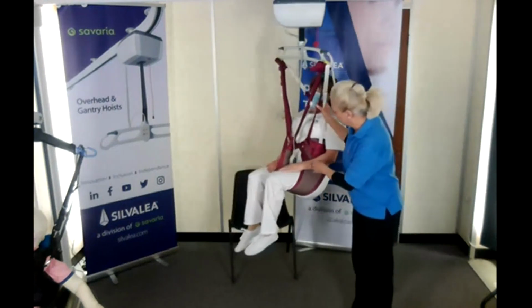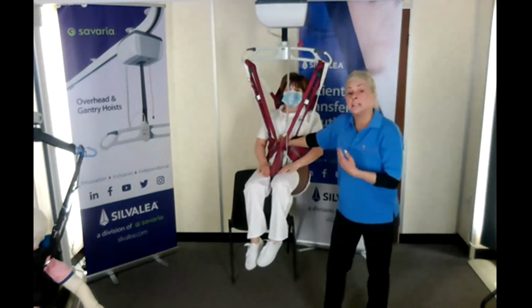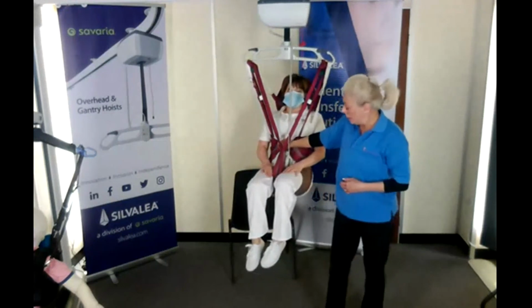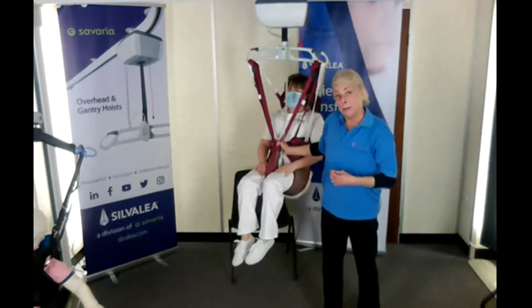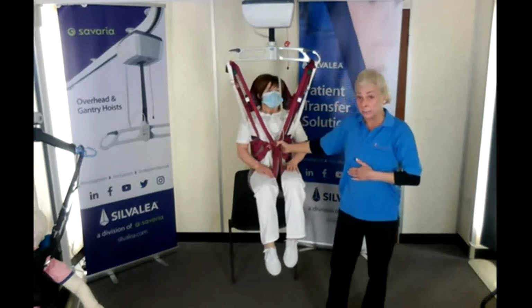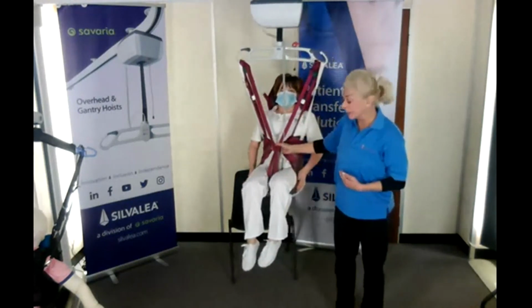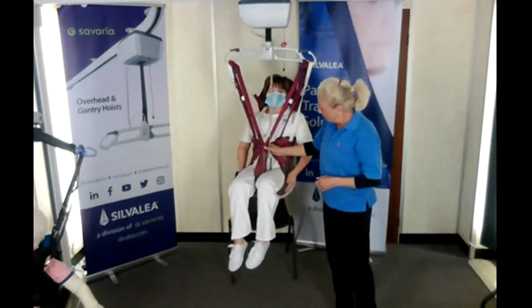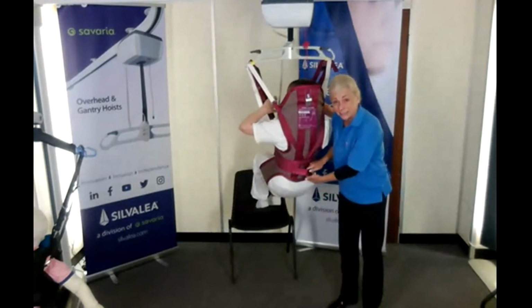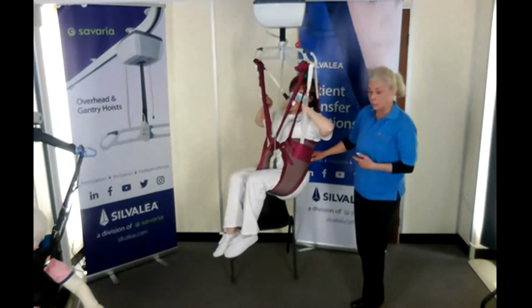The crossover in the front should allow you to get your fingers in. So it is going to give a lot of support for those that have no upper body tone. You need to think about whether it's going to be too tight. Certainly with young ladies, it will push the bust up. It has got a free area here, so it's quite good if someone's peg fed rather than having the waist support. But it might bite in. So if you've got someone very shapely, it might bite in. You've got to think about that, weigh it up as to whether it's going to be suitable.